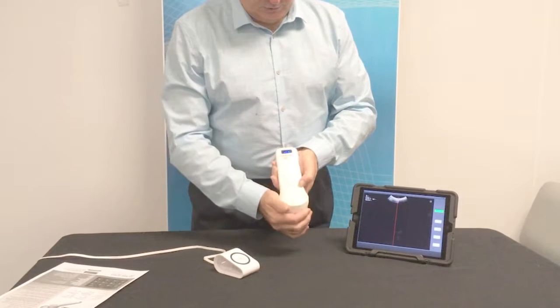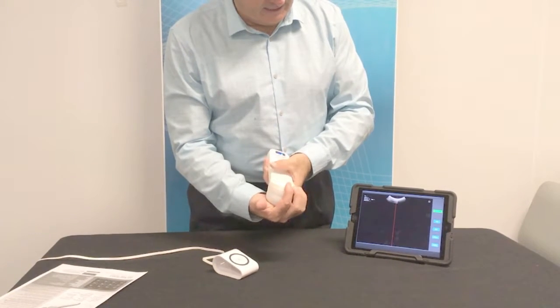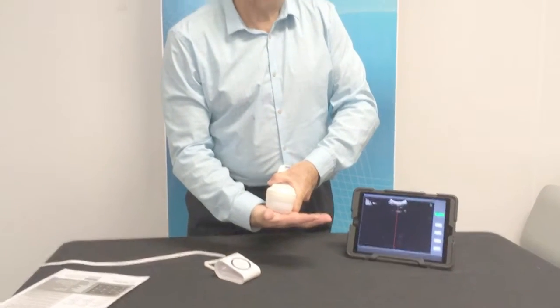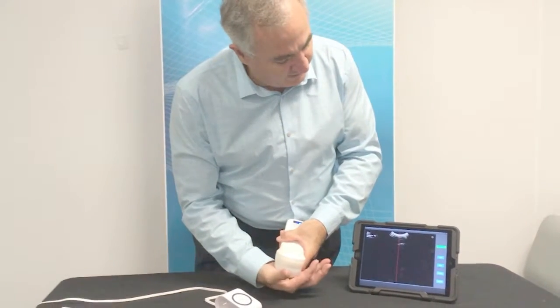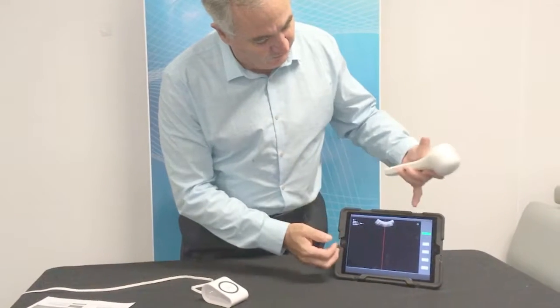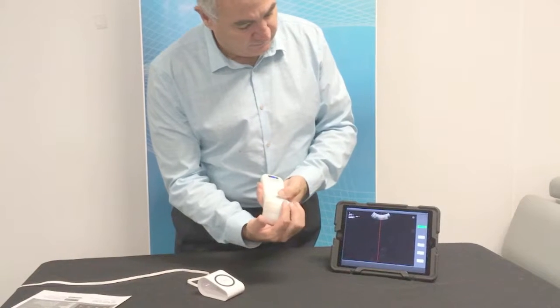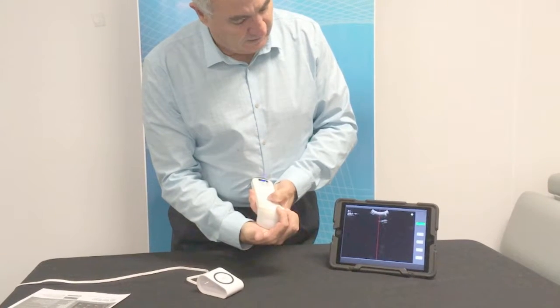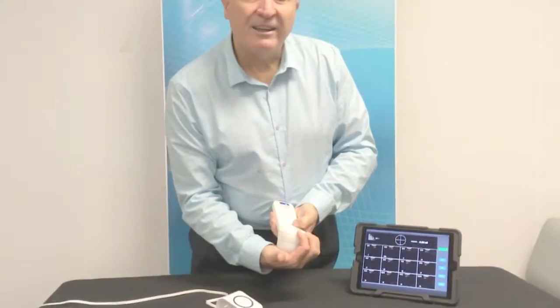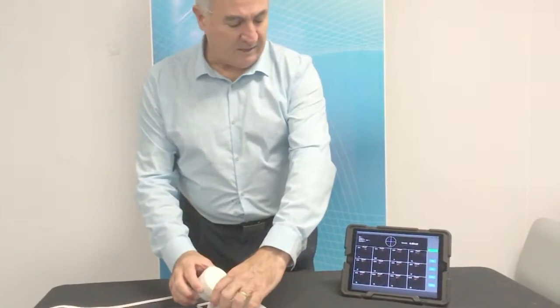To scan, you'll push the button on the probe, which activates it to live scanning. You can then find the centre of the bladder. Once you've found the centre of the bladder, there will be a light in the top right hand corner of the screen. You then push the button again and the probe activates, takes the measurements and displays them on the screen.